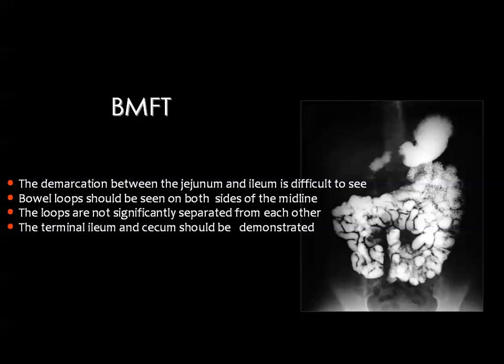to have regular or sequential films for the small bowel, demonstrating the flow of barium through the different parts of the small intestine, including the jejunal and ileal loops, until we reach the region of the ileocecal junction. Then the examination is considered finished.